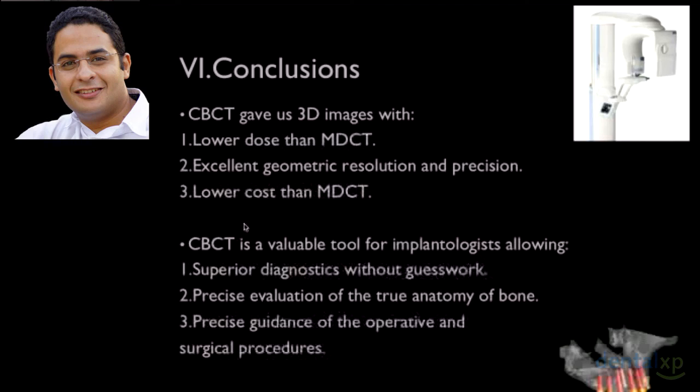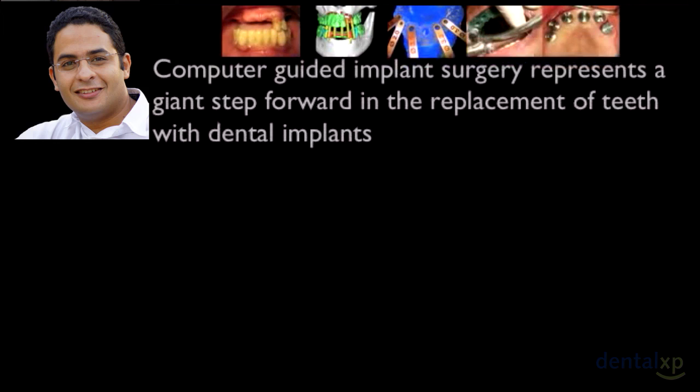beautiful immediate post-operative pictures. So in conclusion, we can say that CBCT gave us 3D images with lower dose than medical CT, excellent geometric resolution and precision, and much lower cost than the multi-detector medical CT equipment. And we also can conclude that cone beam CT is a valuable tool for implantologists, allowing superior diagnostics without guesswork, precision, evaluation of true anatomy of bone, precise guidance of the operative and surgical procedures.